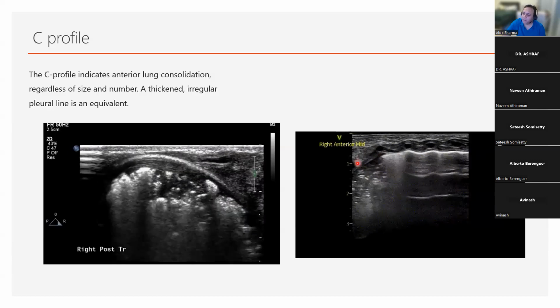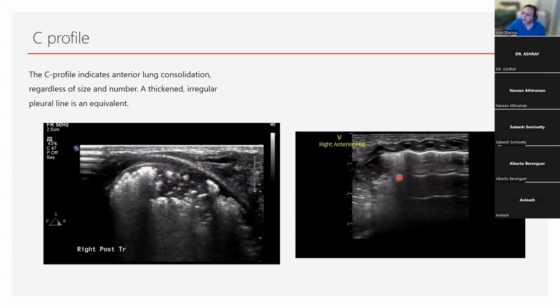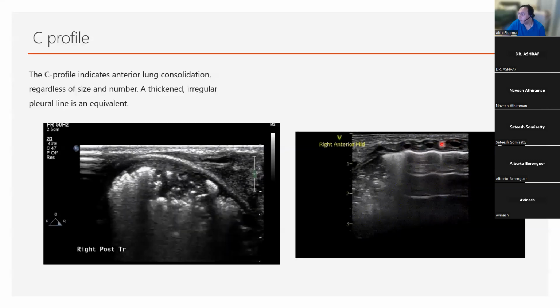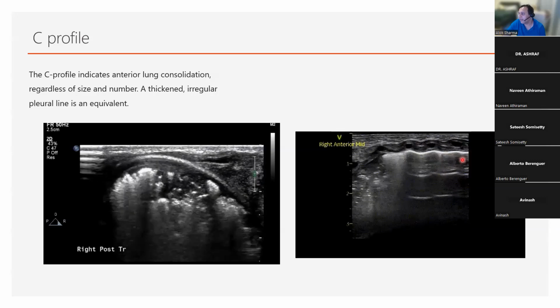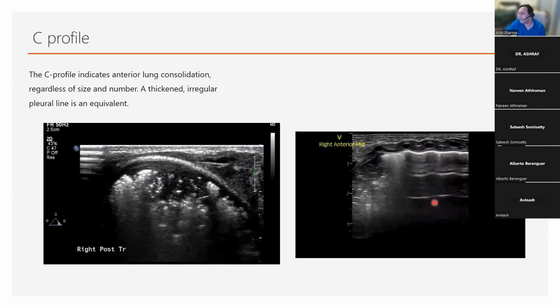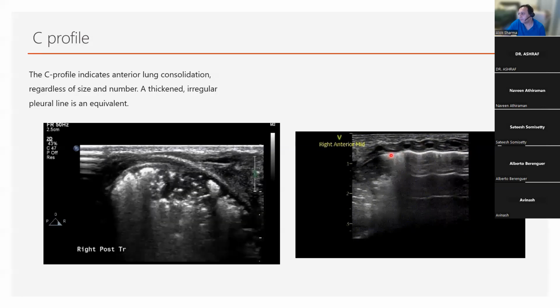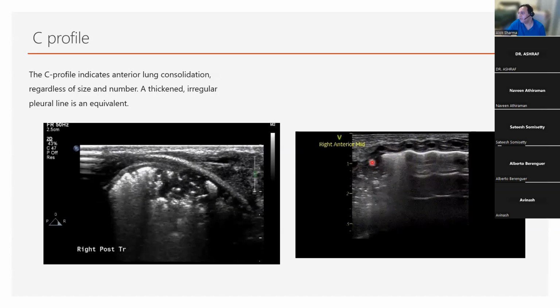And really, upper lobe of R1, rather than seeing an A profile, as you can see, well aerated lung over here. So just describing it to you in detail, I've got a batwing sign, I've got ribs, I can see 1, 2, 3 intercostal spaces. I can see pleura, I can see pleural sliding because I can see these comet tails that are moving. And then I've got these A lines that slightly attenuate. So I've got really well aerated R2. But when I look at R1, I can't see a pleural line. I can definitely make a batwing there, the two ribs, but there's no pleura.